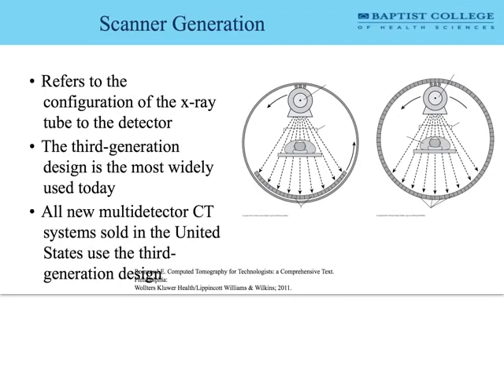And then everyone's like, well, wait, hold the phone. What's the deal with the 4th generation? The 4th generation is almost like that bad movie that you wish they'd never made, like that sequel that was like, oh, I liked the first one, but the sequel stunk, right? That's kind of the 4th generation CT scanner. It's more or less obsolete now, but the idea with it was let's line the entire gantry tube with detectors, and we can scan that much more quickly. It didn't turn out to be that advantageous.